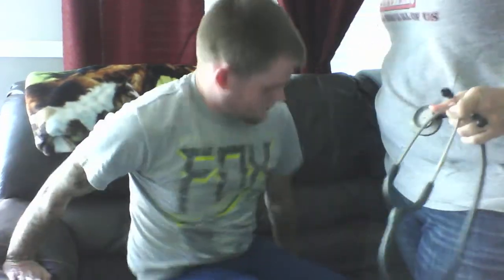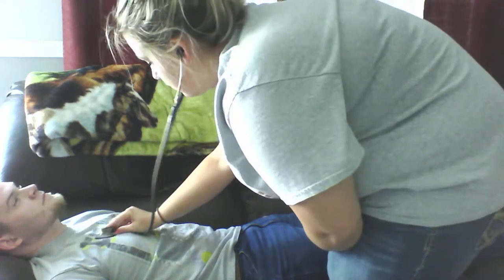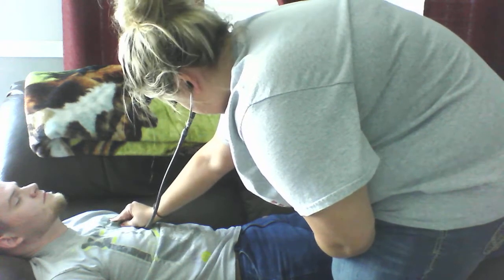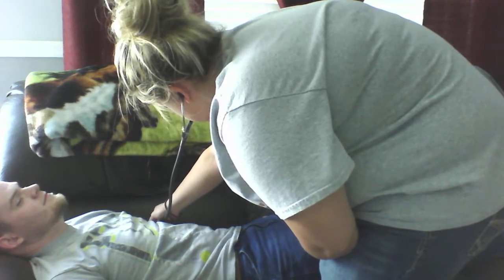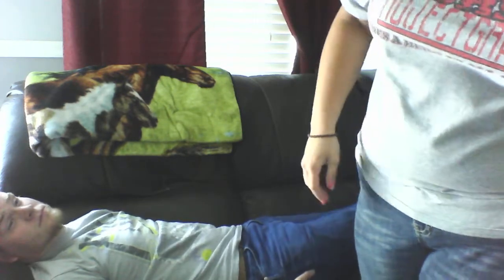So then I can have this patient lay down really quickly. Just put your head that way for me. Great. We're going to go ahead and repeat our cardiac assessment, just listening again to all of these. Aortic, pulmonic, Erb's point, tricuspid, and mitral. And I don't hear any abnormalities with that either, so that is a normal finding.